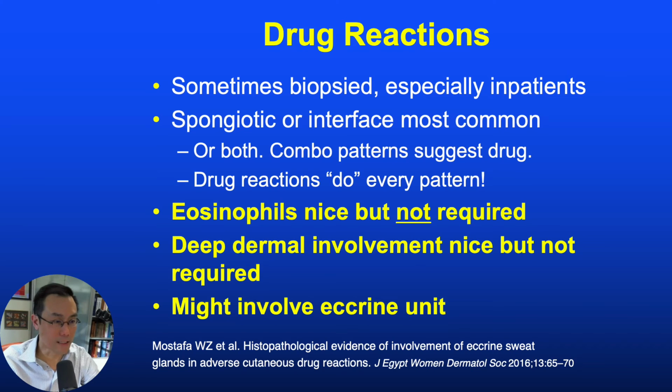Although I found this last little tidbit to be interesting, we see, and there is some evidence to support that, the inflammation in drug reactions might have a predilection for the eccrine unit. And this reminds me of one of the many wise teachings of my former attending, Dr. Timothy Berger at UCSF. This would not be based on inductive reasoning or deductive reasoning, but perhaps seductive reasoning. But in this case, there actually is some evidence to support the assertion as cited below.